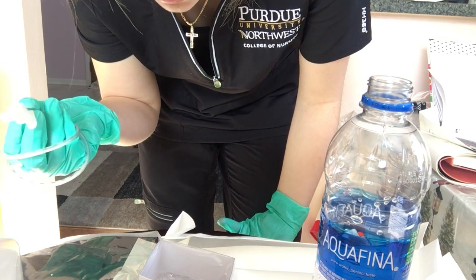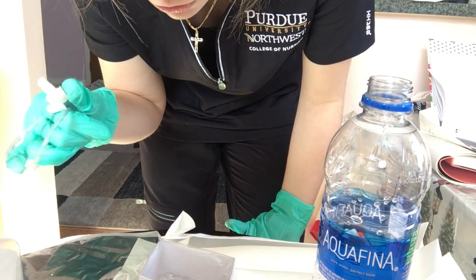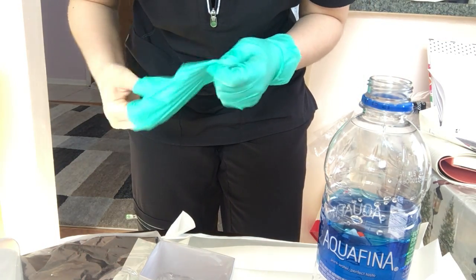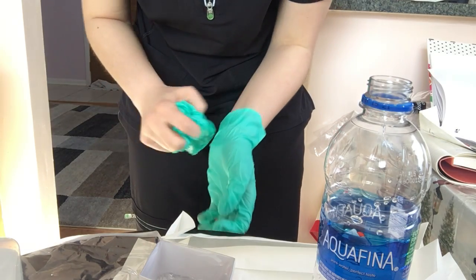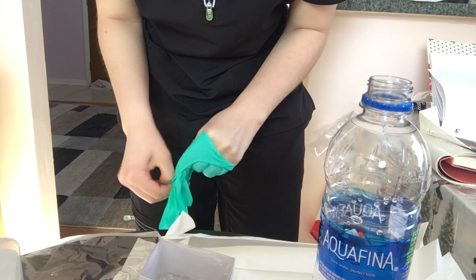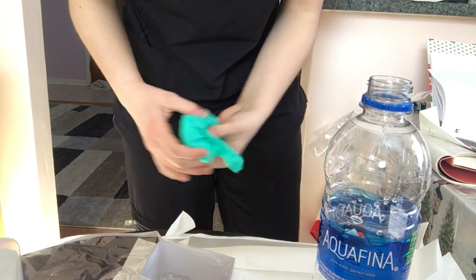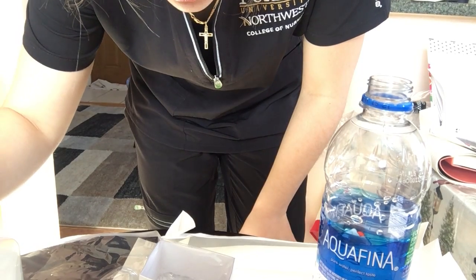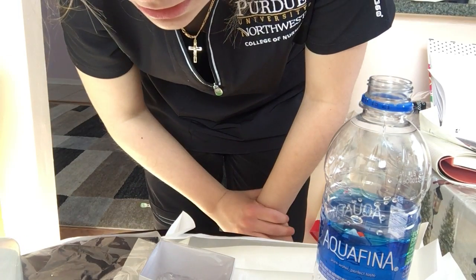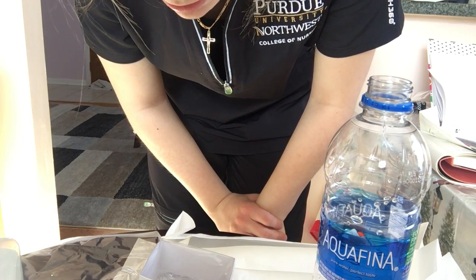So when the suctioning is done, we would then remove the glove from your dominant hand over the coiled catheter. So we would remove the glove, dominant hand over the coiled catheter. I messed that up a little bit. And then we would dispose of the gloves, the catheter, and the container with the solutions in the appropriate receptacle.